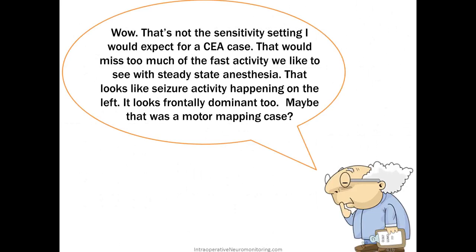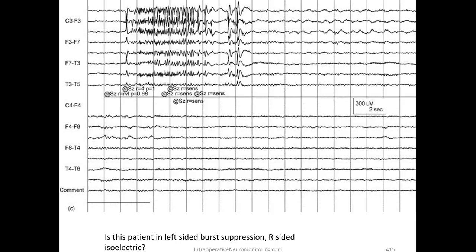Okay, moving on. Wow, that's not the sensitivity setting I would expect for a carotid case. That would miss too much of the fast activity we would like to see with steady state anesthesia. That looks like seizure activity happening on the left. It looks frontally dominant too. Maybe this was a motor mapping case. So we have activity here.